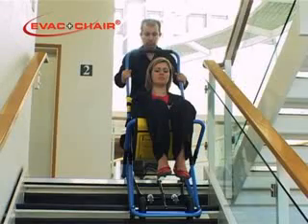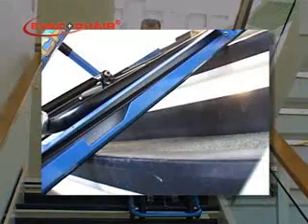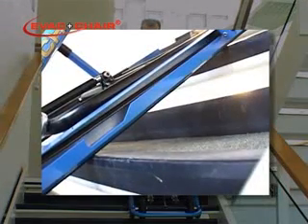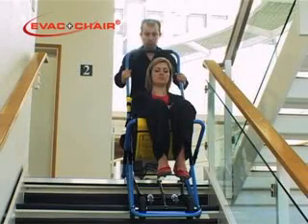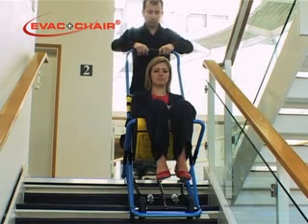At all times, stay near the inside edge of the stairs and make certain the skis make contact with the top two stair nosings. Never let go of the evac chair. Pause briefly and reposition your hands by sliding them upwards from the vertical position at each side of the handle onto the handle's horizontal top crossbar.